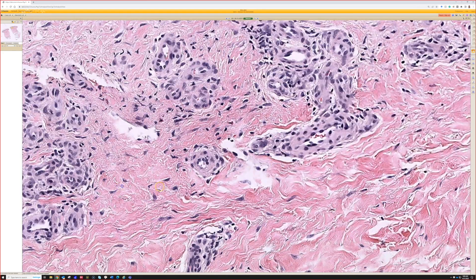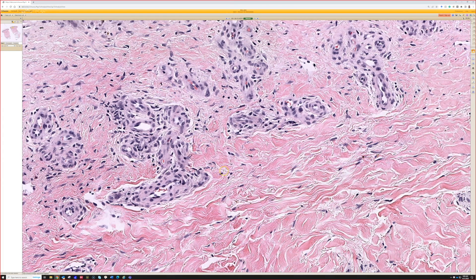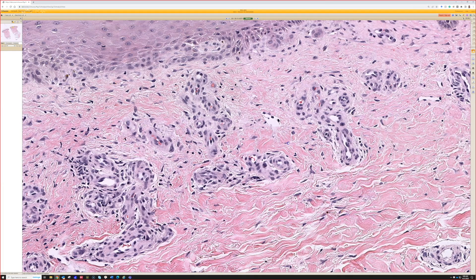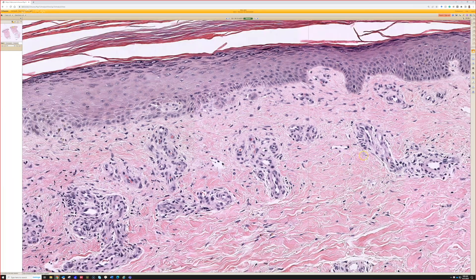So what do you think? It looks like what we see on a lot of our biopsies from the lower legs — just stasis changes.